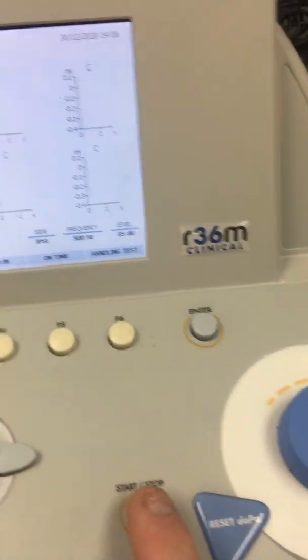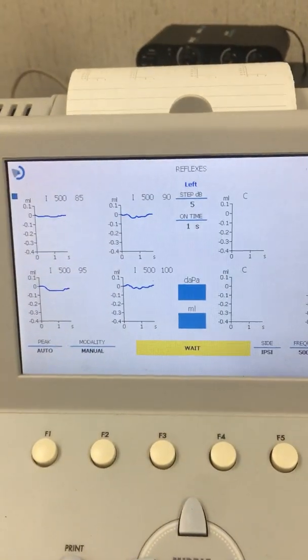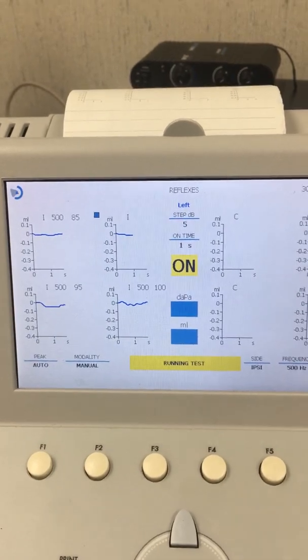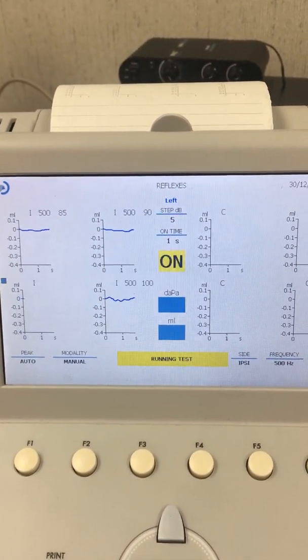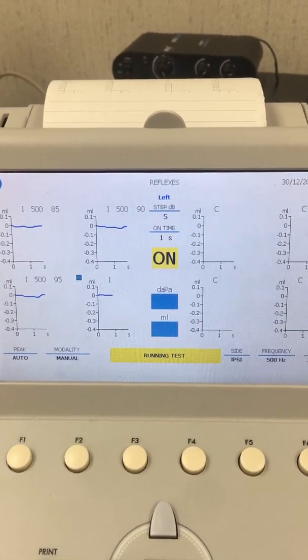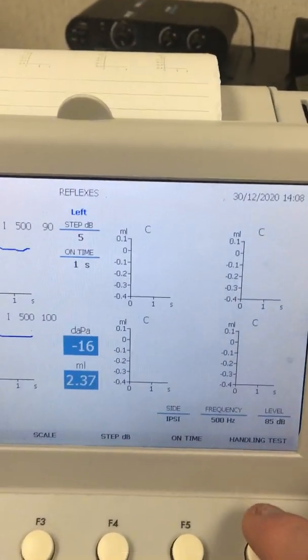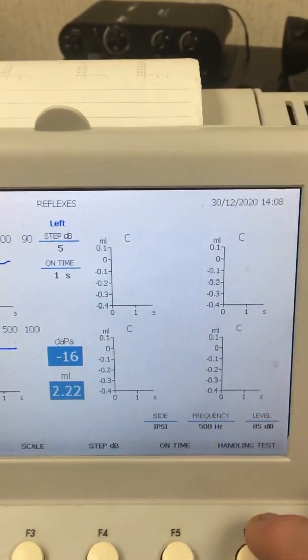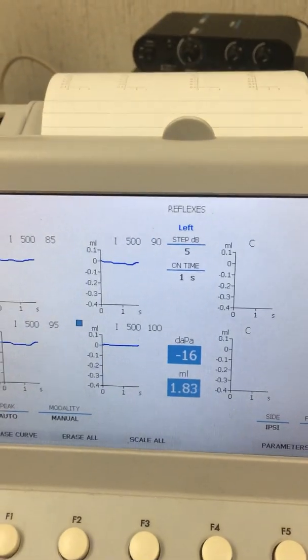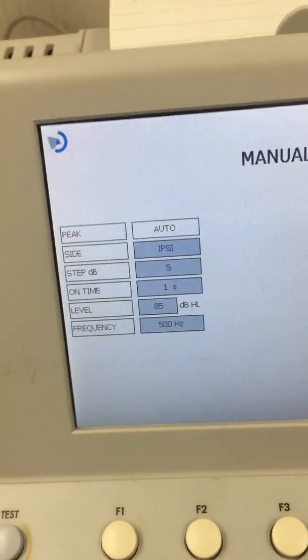Okay, if you want to change those, the next, go to the next frequency, you go to the handling test F6, then go back to F5, scroll down to your start level and you can change that.